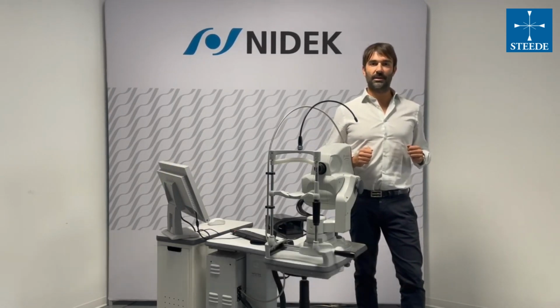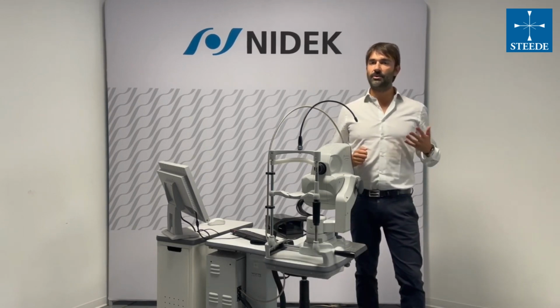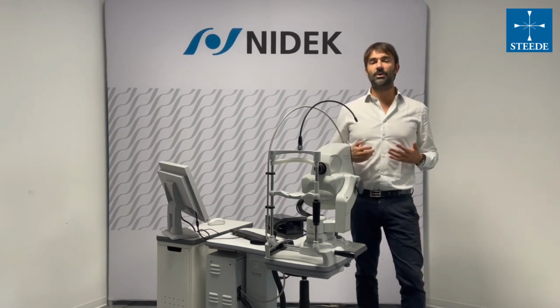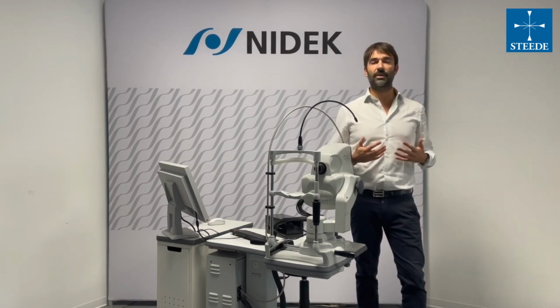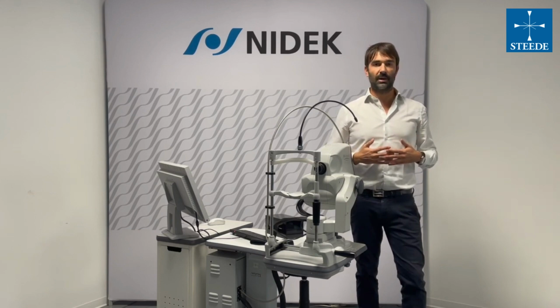I work for Nidek International Division and I'm in charge of retinal imaging products. Today, I'd like to introduce you to the Nidek Mirante, which in my opinion is the pinnacle of more than a decade developing high-quality retinal imaging technologies. Now, finally fully integrated into one single, powerful multimodal imaging platform. So let me show you what Mirante does and how it works.